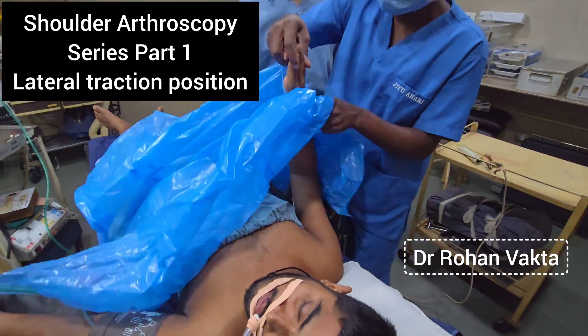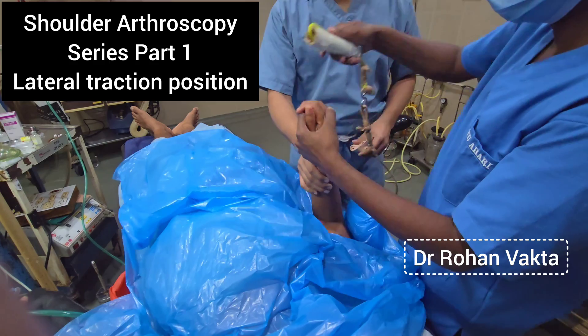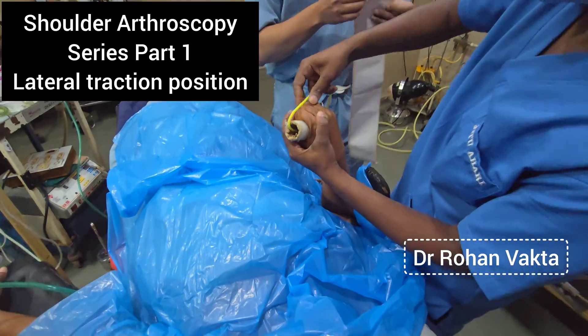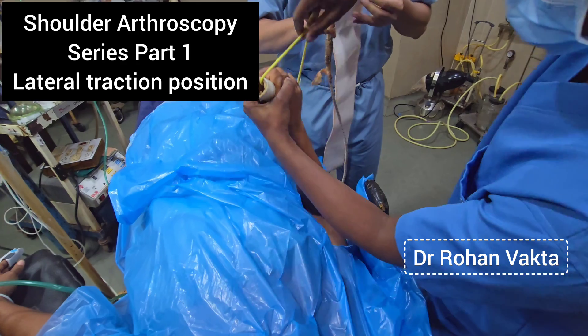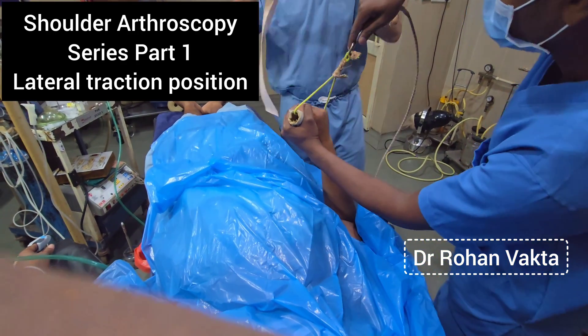In shoulder arthroscopy, there is a lot of fluid which comes over to the patient, and once the patient is out of anesthesia, because of the large amount of fluid, the patient can go into hypothermia. It is better to cover the entire body with a plastic drape so that the water or normal saline doesn't fall on the patient's body.